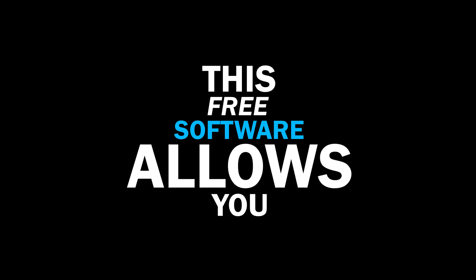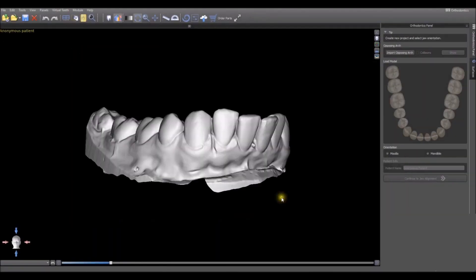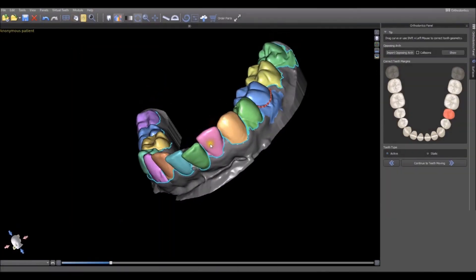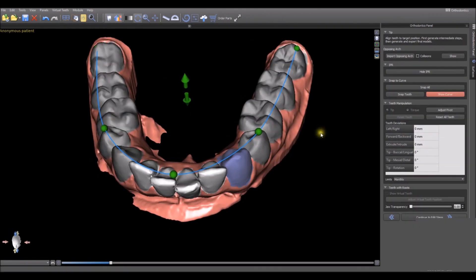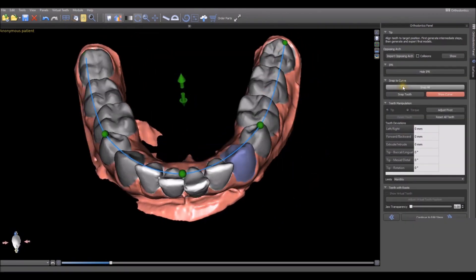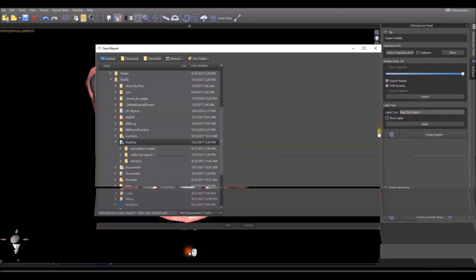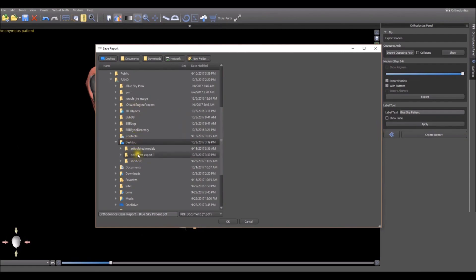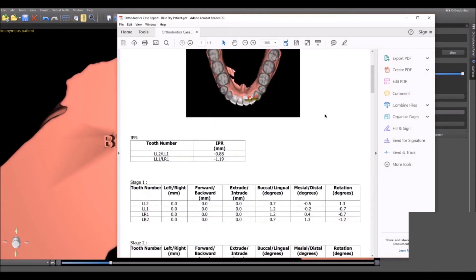This free software allows you to load the patient's models, isolate the individual teeth, align the teeth to the ideal occlusion and aesthetics, and then export models and/or aligners for each aligner stage.